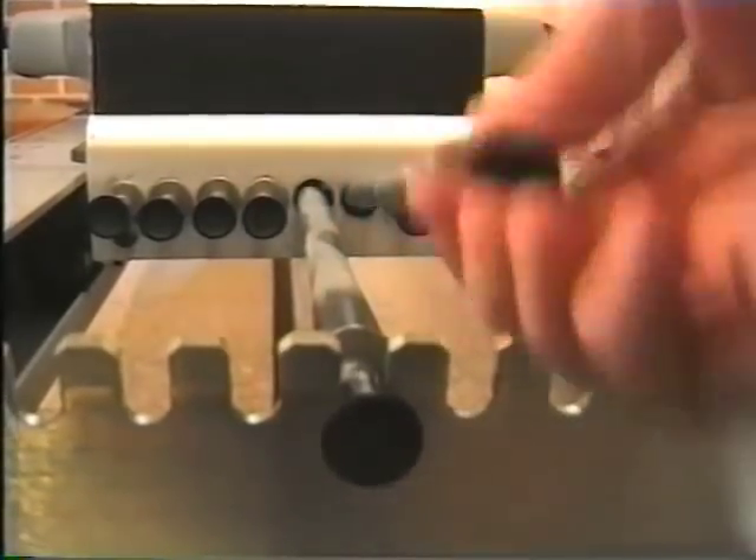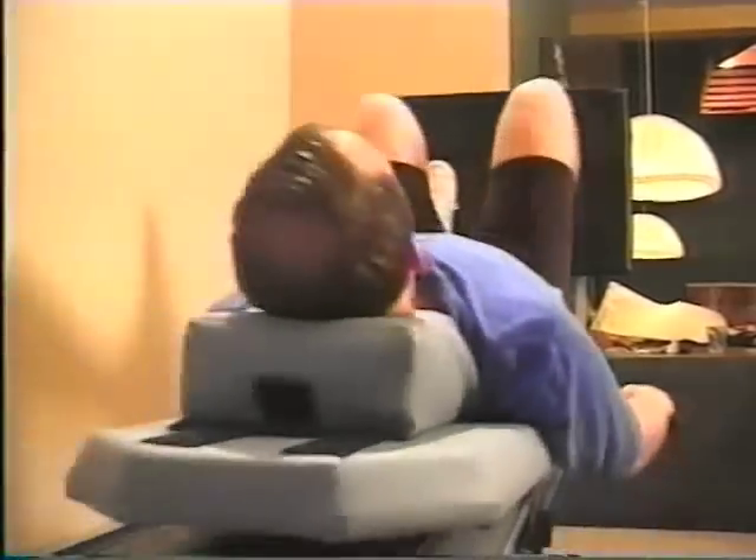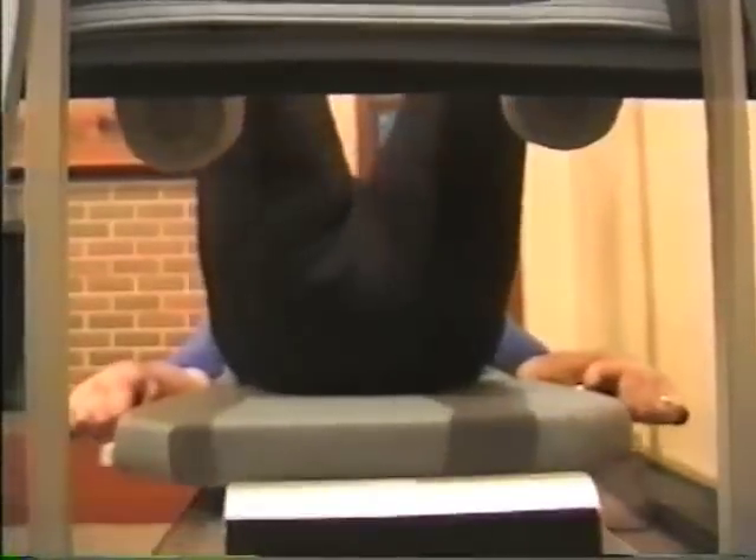Elastic cords can be easily added or subtracted without the patient having to get off the shuttle. As an end stage goal for strengthening, athletes can progress to plyometric drills. However, ask any athlete recovering from an ACL how excited they are to begin jumping full weight bearing. It's much easier to introduce plyometrics on the shuttle, which offers a more controlled and safer environment.